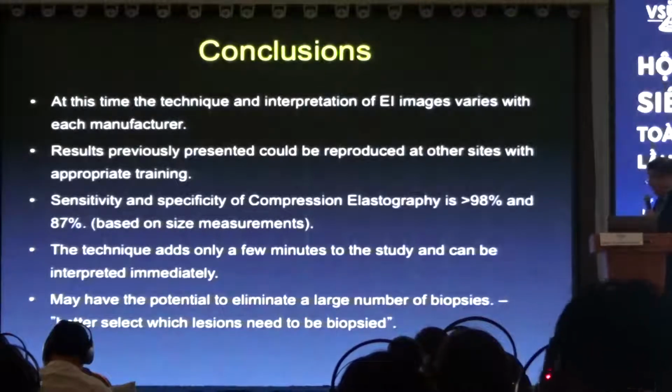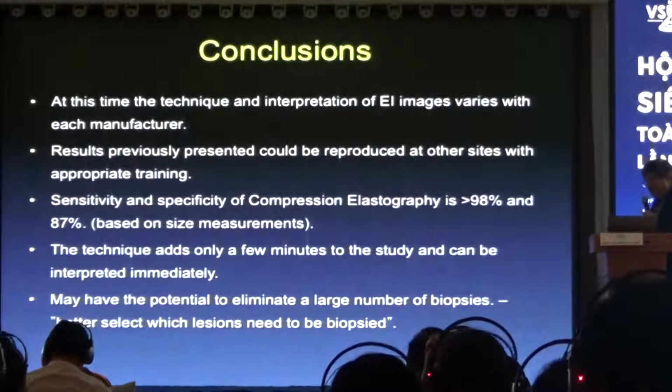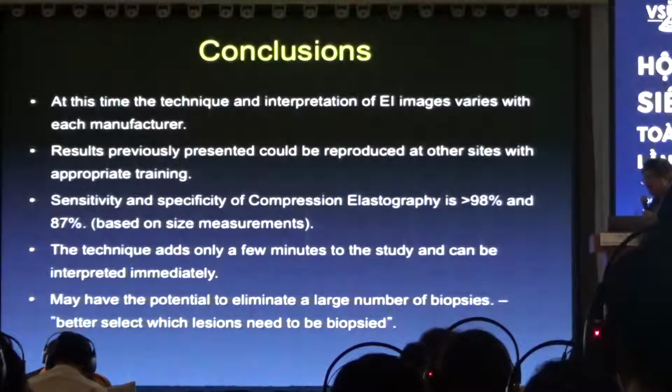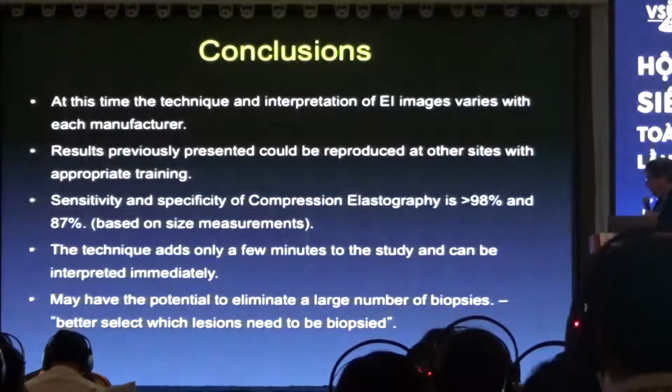And again, if you look at our studies, our positive biopsy rate was about 20% when we started, and now it's 80%. So the number of biopsies that we have eliminated is huge. And we make a very big impact on women. And we do this real time so that we tell the patient the results when she's there. And it's very helpful for them. And they're all very happy if we can cancel a biopsy because she doesn't need it. Really only adds a few minutes once you're trained.